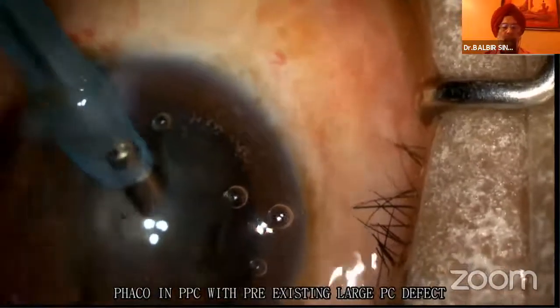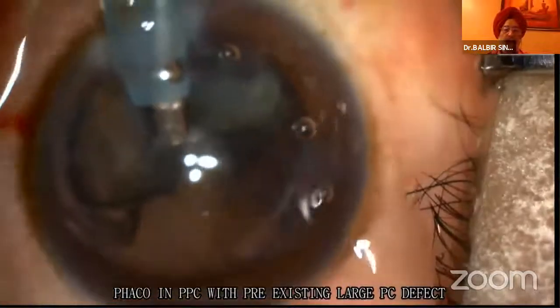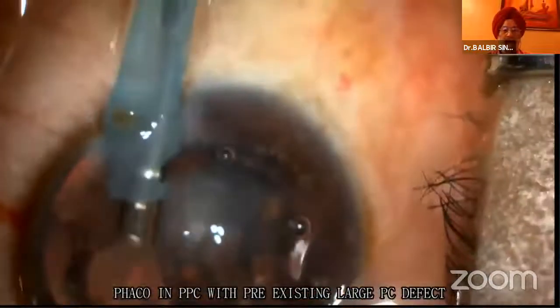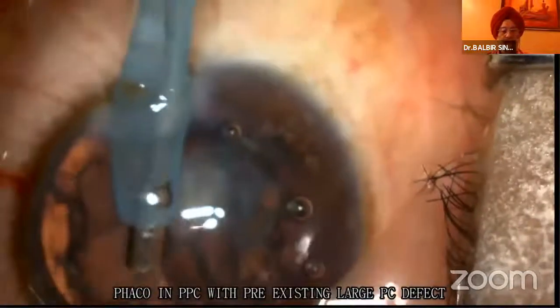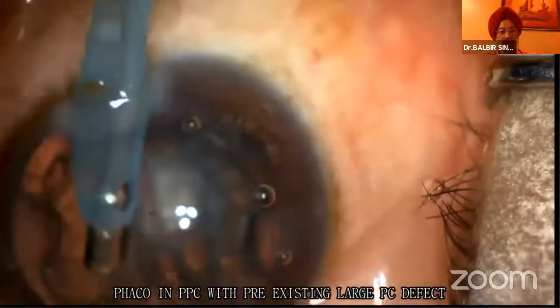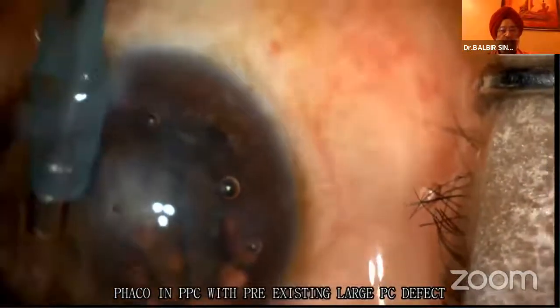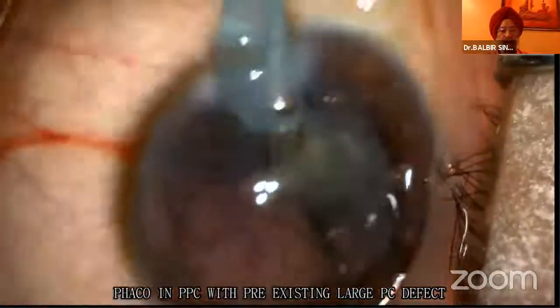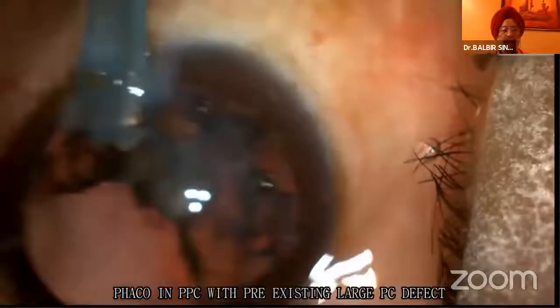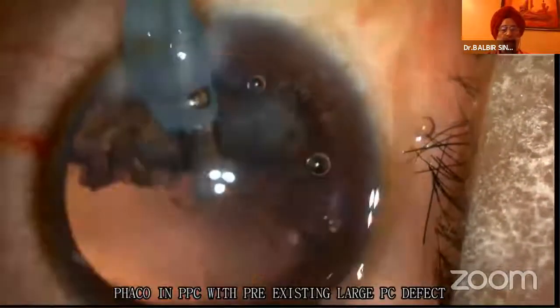I'm trying to remove the soft cortical nuclear material and epinucleus with the phaco tip. It is under topical anesthesia. Shortly you will see very clearly the margins of the tear, extending from limbus to limbus.